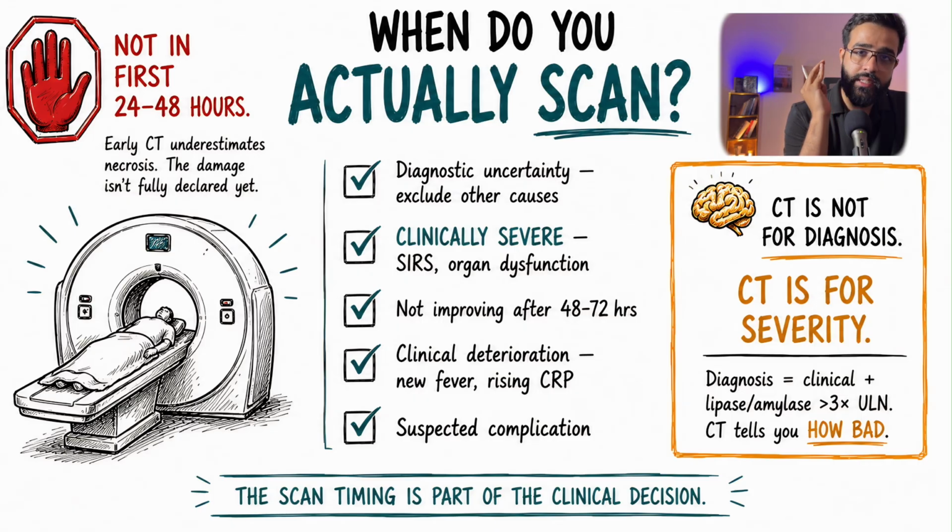An early CT, especially in the first 24 to 48 hours, can actually underestimate severity. The full extent of necrosis does not become visible until 48 to 72 hours in. So when do we actually scan? The ACR and IAP indications for CT in pancreatitis.